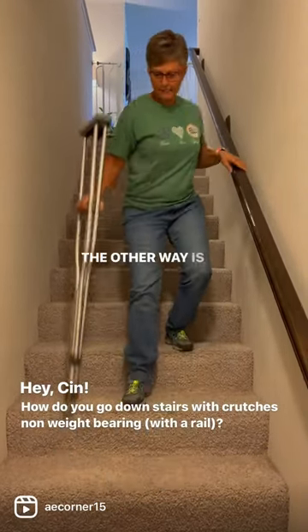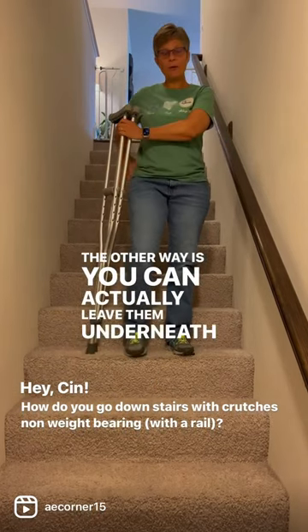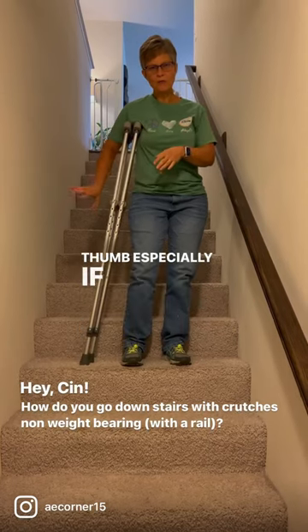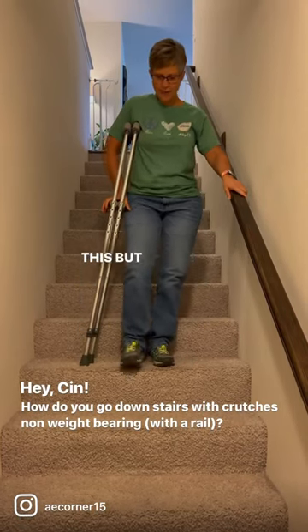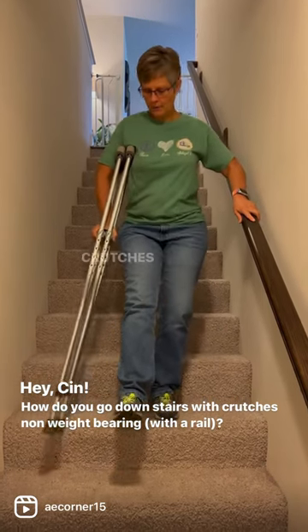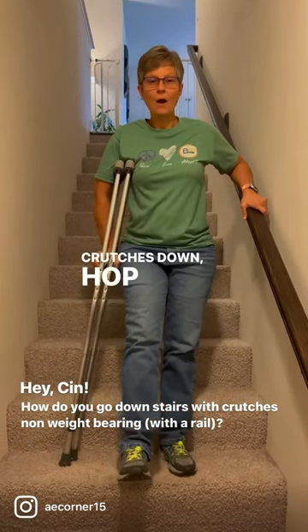The other way is you can actually leave them underneath your arm. You got to be very careful. Don't hang on these and watch your thumb, especially if you're putting a lot of weight through this. You're going to put your crutches down and hop down. Crutches down, hop down.